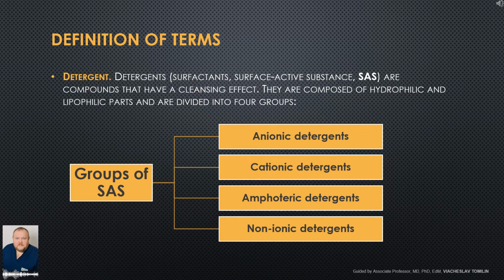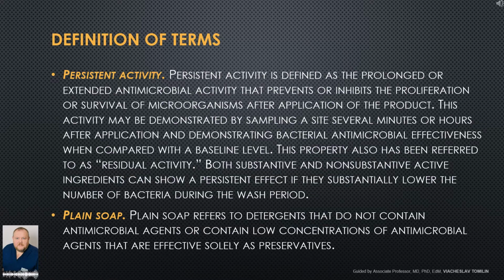Detergent, that is, surfactants, surface active substance, SAS, are compounds that possess a cleaning action. They are composed of both hydrophilic and lipophilic parts and can be divided into four groups: anionic detergents, cationic detergents, amphoteric detergents, and non-ionic detergents.